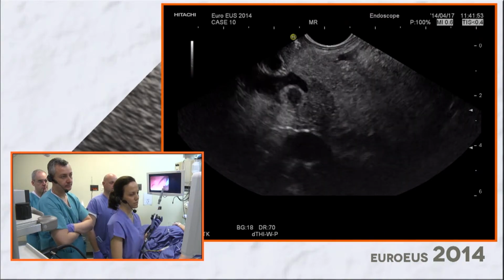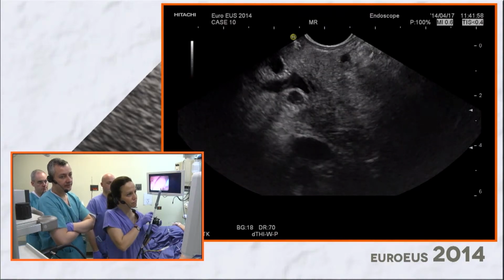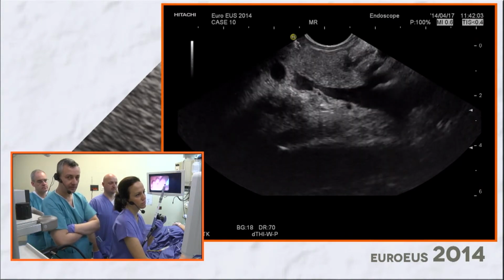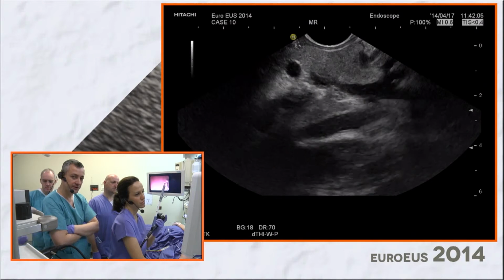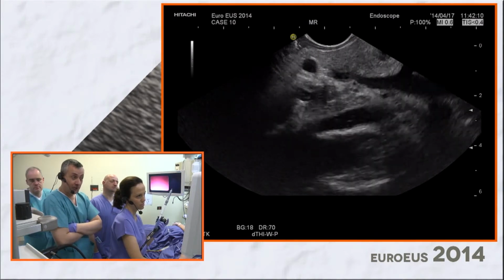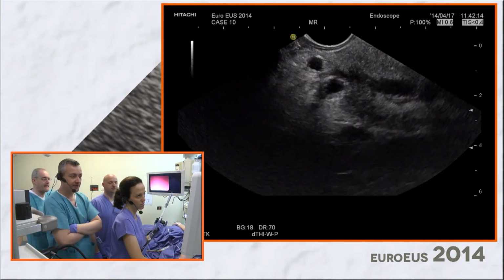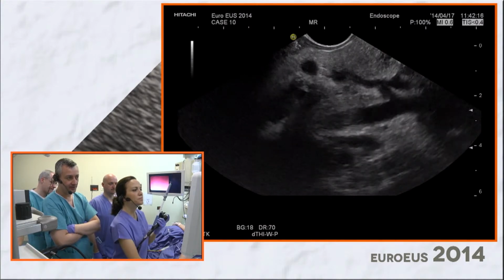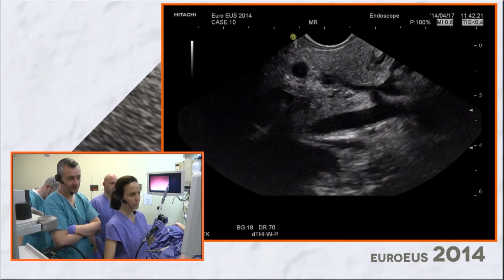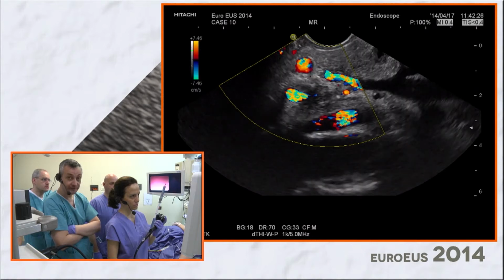Puncture is not easy in this case. You have a long route. Yeah, it's a difficult position, and also with a 25 gauge needle, probably the probability of getting microhistology and cell blocks would be lower. So the differential diagnosis between a primary pancreatic adenocarcinoma and a secondary lesion, a secondary metastasis, would be quite difficult, unless we get microhistology, and it's not so frequent to get that with a 25 gauge needle.